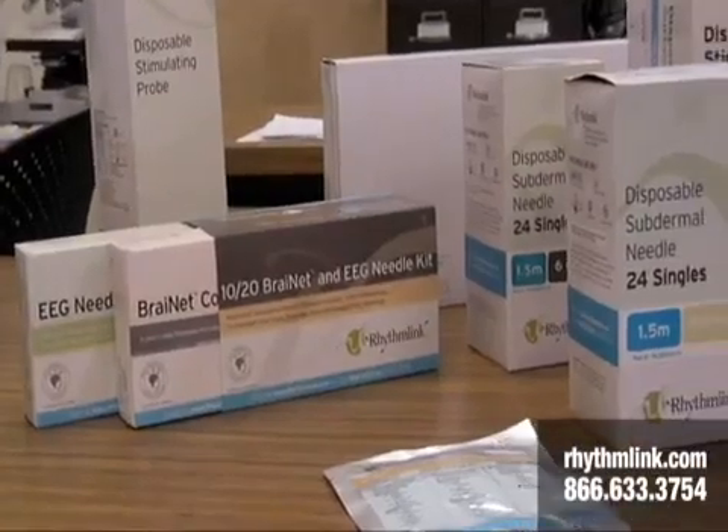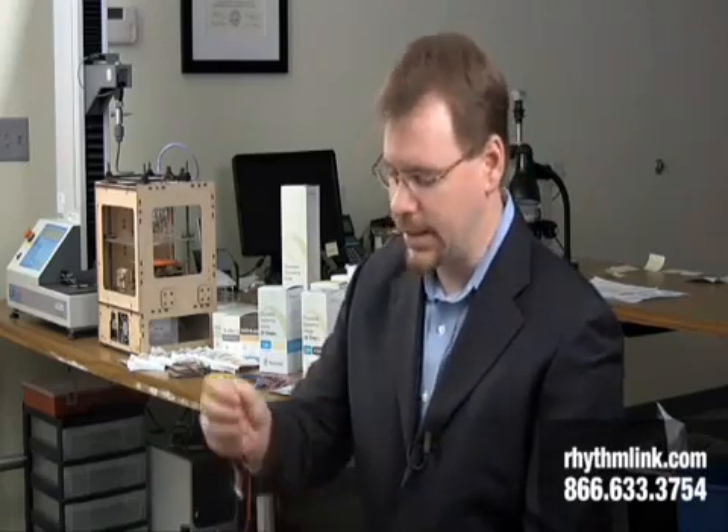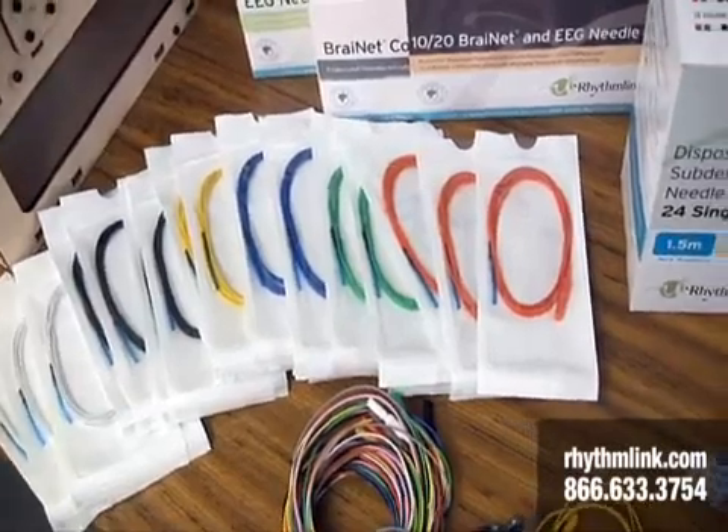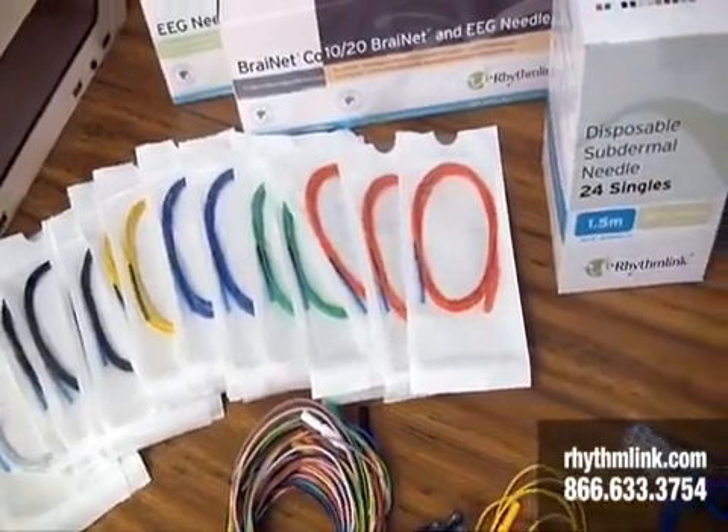Now we'll talk about RhythmLink's subdermal single needle and paired needle electrode groups. Right here we have a single subdermal needle electrode. The red is the lead wire. These lead wires come in various lengths: one meter, one and a half meter, and two and a half meter lead wire lengths.